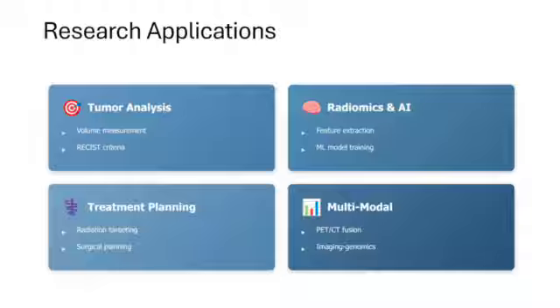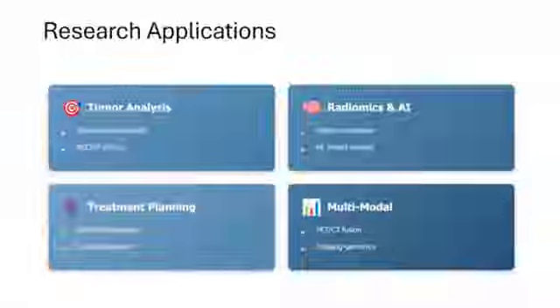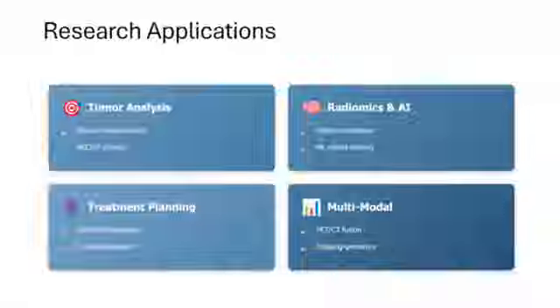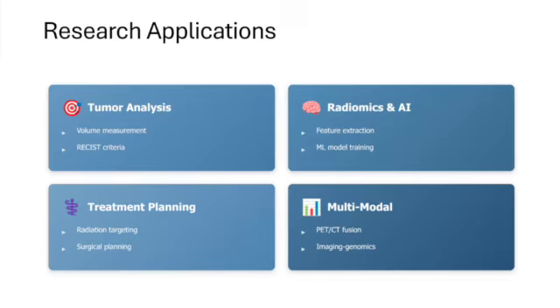RECIST criteria. RECIST stands for Response Evaluation Criteria in Solid Tumors, which is a standardized set of rules to evaluate how the clinical treatment's working. So you could essentially develop automation around looking at the RECIST criteria. Radiomics and AI: of course, extracting features and training machine learning models.